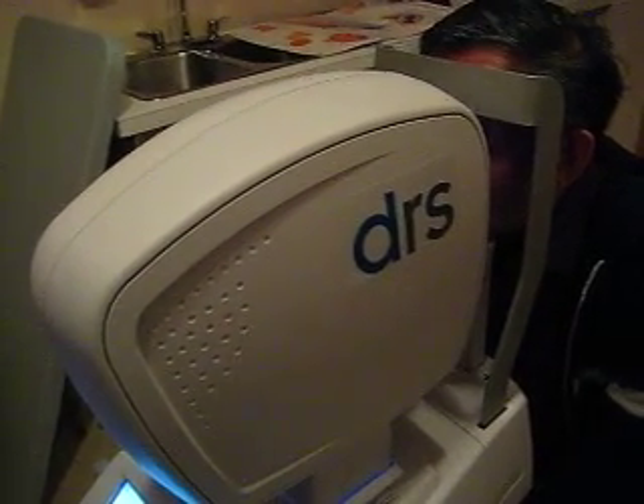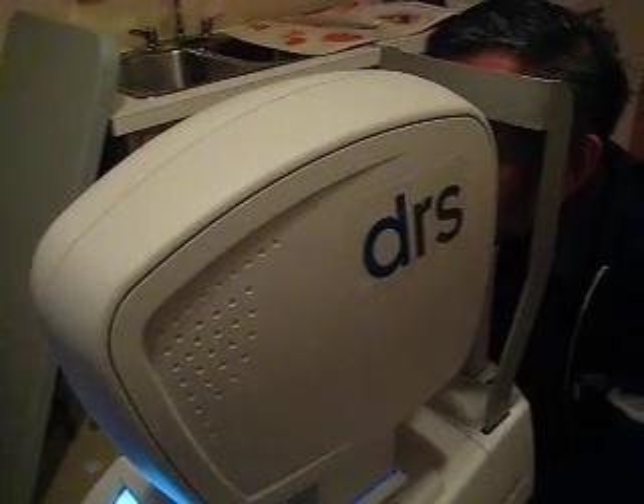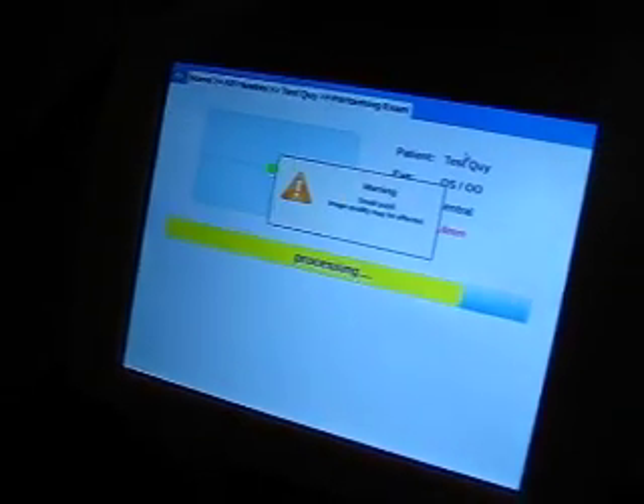Shortly, you'll see the green light. If you would please just concentrate on that green light — just look at that green light. Absolutely perfect. Our focusing is done, and we're continuing to focus. There we go. And the image is taken. So you're complete right now. Thank you very much.